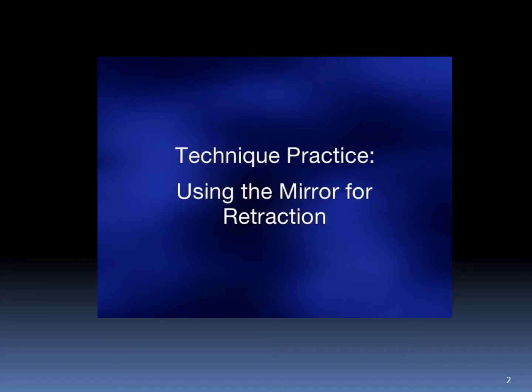Retracting the buccal mucosa away from the facial surfaces of the posterior teeth can be a challenging task, especially if your patient tenses his or her cheek muscles. Correct retraction technique reduces the likelihood of stress to the muscles of your non-dominant hand.